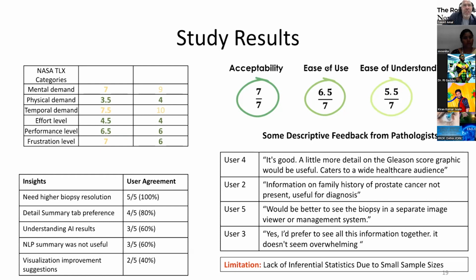This way we provide pixel-level and patch-level segmentation of those Gleason areas, and we color it based on the severity. The pathologist can see that the ISUP grade is 4, then go into the biopsy and see the areas that we marked up and focus on those areas to make sure that this grading is accurate and can be trusted.